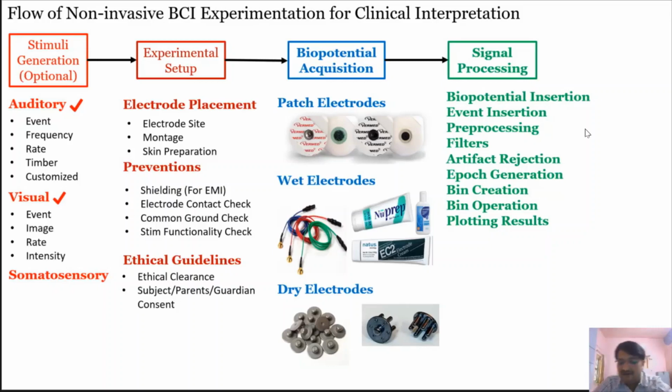All these things are very important when discussing the signal processing aspects of an EEG recording system. So this would be the final, very detailed view of any brainwave recording system or brain computer interface system.